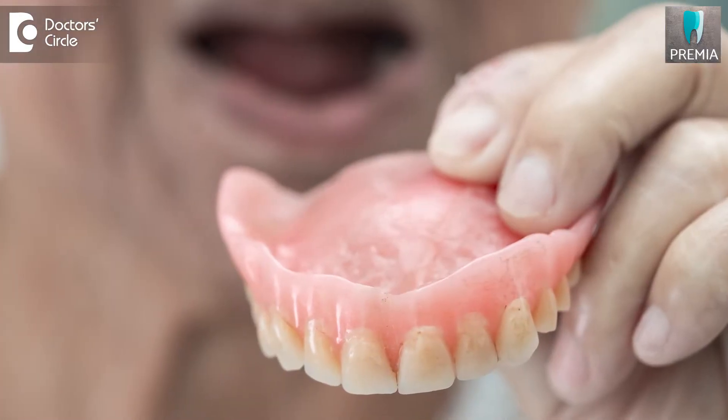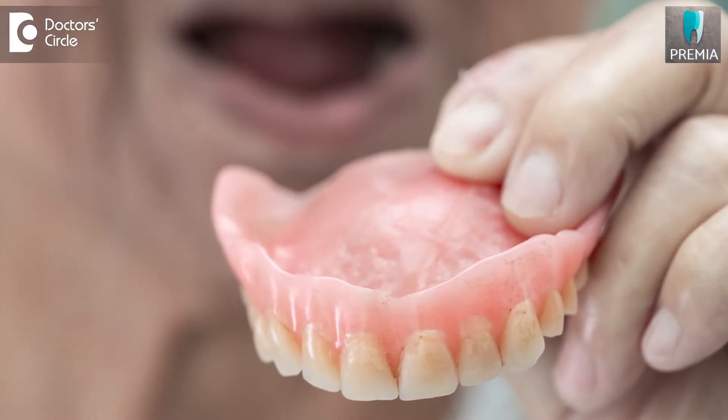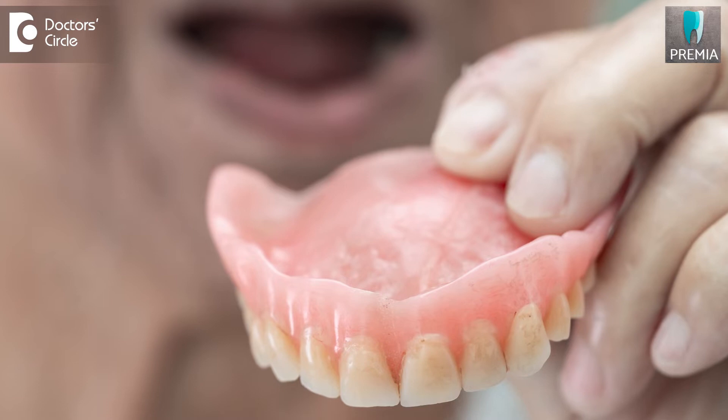Usually the maxillary dentures do not cause as much of a problem with retention — meaning they will stay in position — because of the amount of bone that is available. Whereas with mandibular dentures, patients usually complain that the dentures are loose. The main reason is that the amount of bone available is much lesser, which is why mandibular dentures are less retentive.